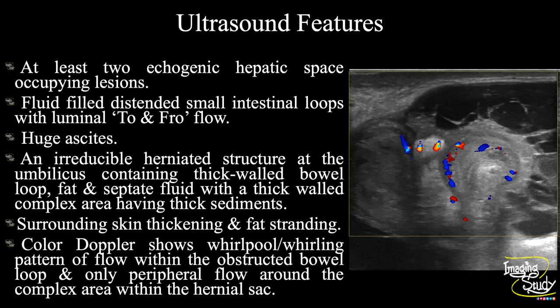Fluid-filled distended small intestinal loops with luminal to-and-fro flow were seen, suggesting small intestinal obstruction. Huge ascites was seen. Regarding the cause of intestinal obstruction, an irreducible herniated structure was noted at the umbilical region containing a thick-walled strangulated bowel loop with thickened fat and septate fluid, along with a complex thick-walled area having thick sediments indicating abscess formation within the herniated sac. Surrounding fat stranding and skin thickening were seen. Color Doppler shows a whirlpool or whirling pattern of flow within the obstructed bowel loop suggesting strangulation. The complex mass showed only peripheral flow with no internal flow, confirming abscess.